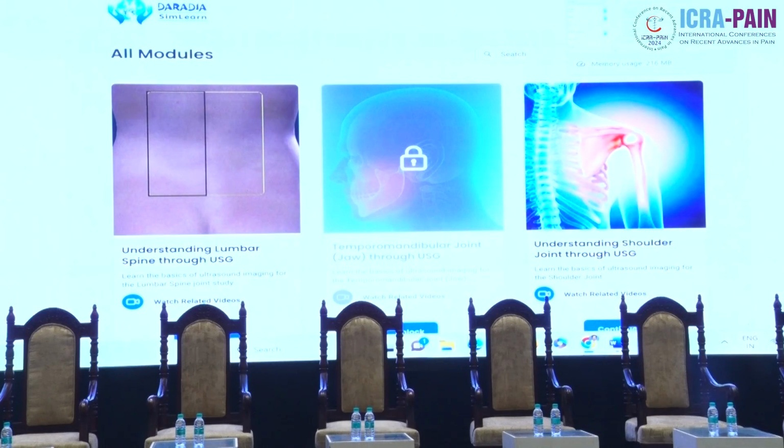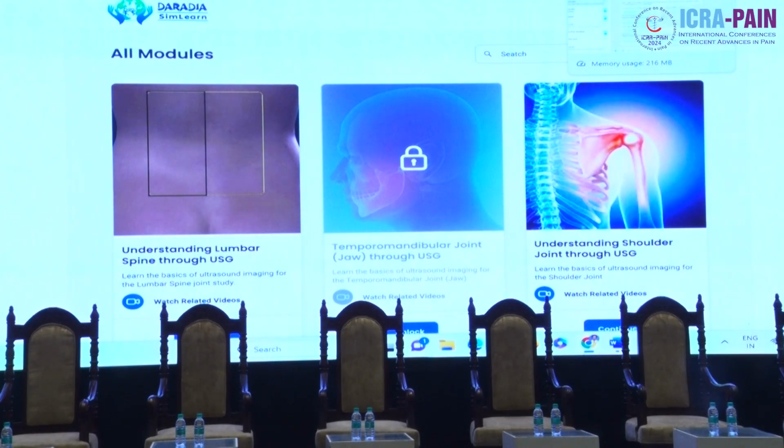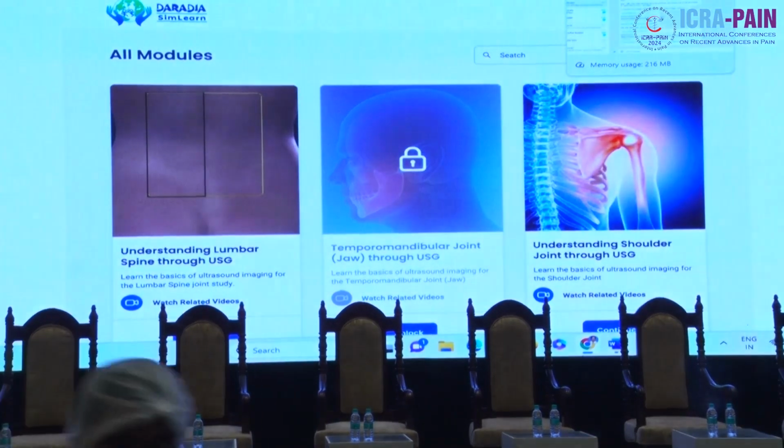What is coming right now? We'll be sending you all the individual login ID and password on your email ID. Whatever I have shown you, you can access and you can do all those things. But some more features are coming, which Nandini will be showing you, which are there in our demo version, but not the actual app.